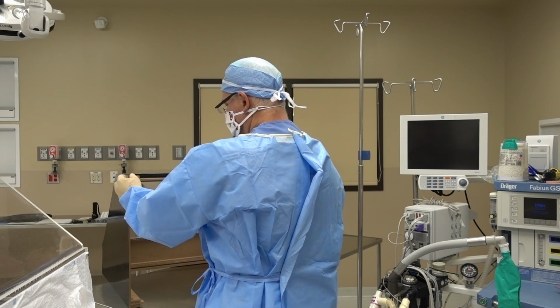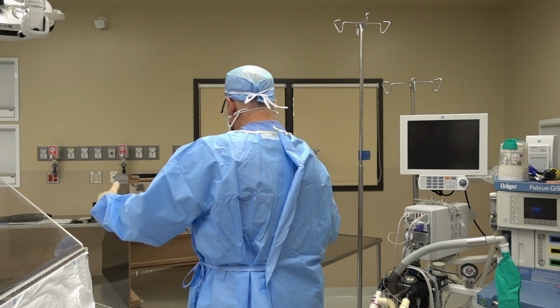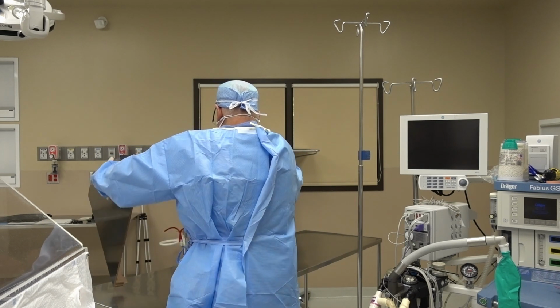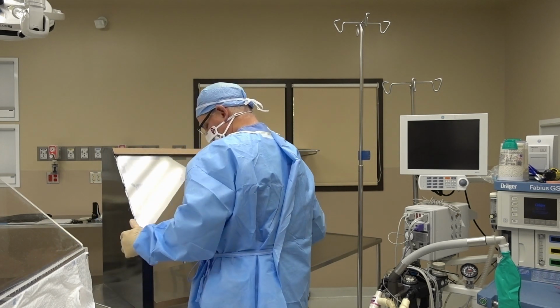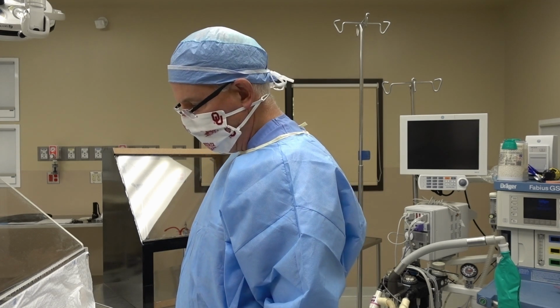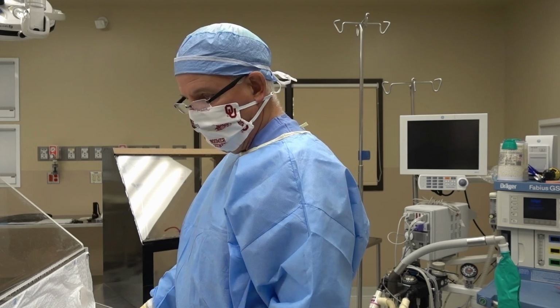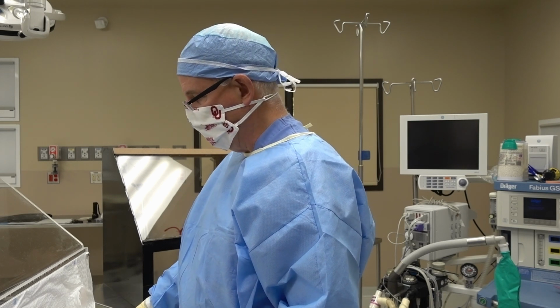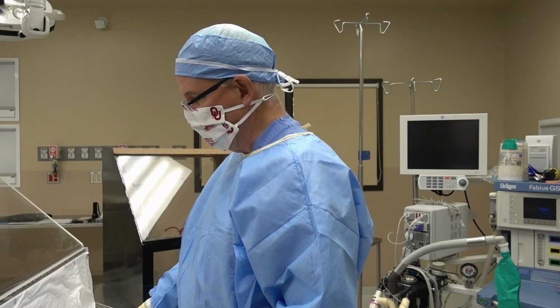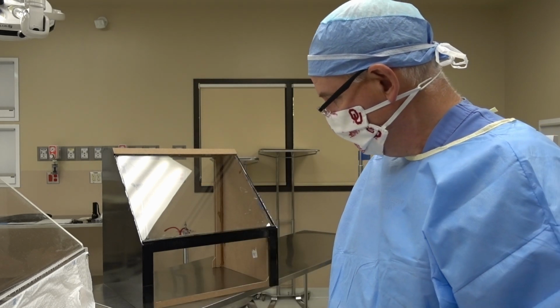And again, you use the weight of the box to keep the bag taut. And again, those bags are just 0.9 mil tall kitchen bags. You can get them at any hardware store, any grocery store. You can order them on the internet. They're quite cheap. Again, 200 for $20 I've seen on Amazon. I hope this helps make us safer. Thank you.